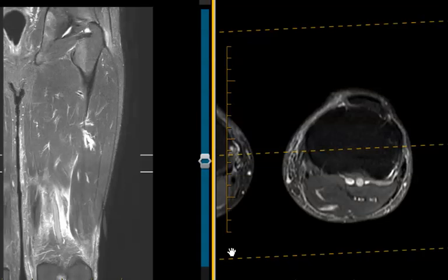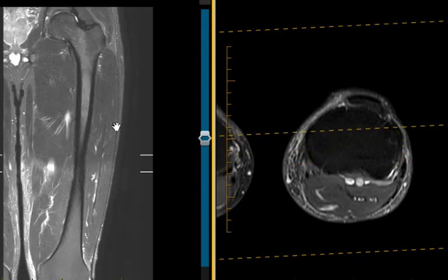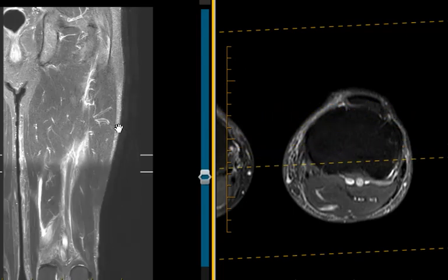Hello, this is Dr. Gay from First Lake MRI. This is a 63-year-old male who injured his thigh water skiing. He's got pain in the back of the thigh in the region of the hamstring muscles, and the doctor thought they may have a tear — and indeed they do.